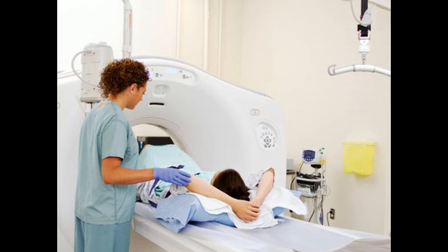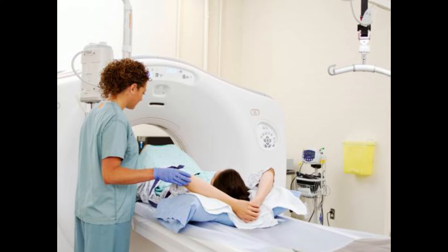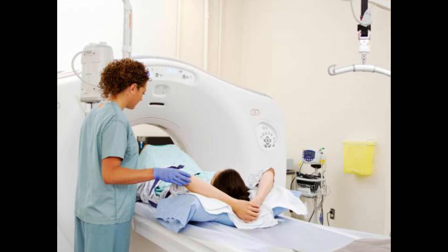Abnormal results occur when hot spots can be seen. Hot spots are areas of the bone that have collected an excessive amount of the radioactive tracer. These spots may indicate a problem such as a bone infection, cancer, or simply a bone fracture that has not yet fully healed.